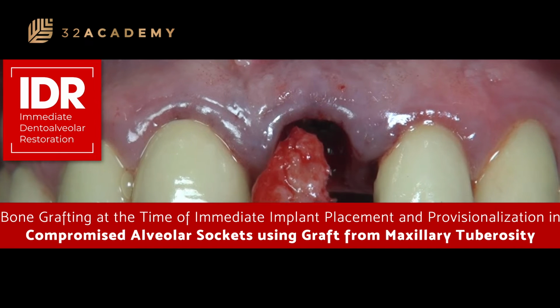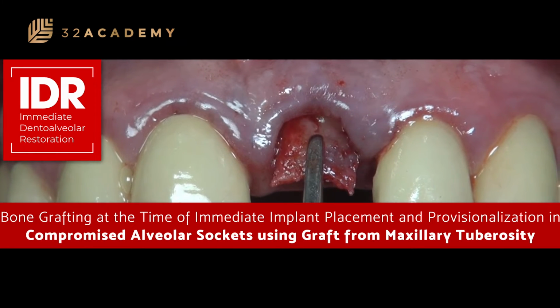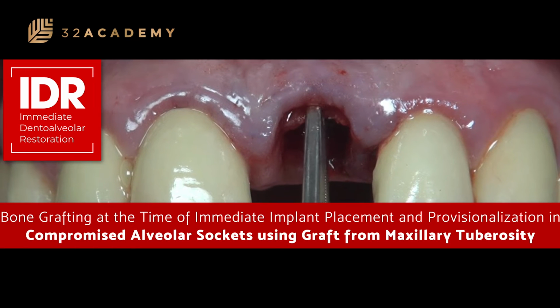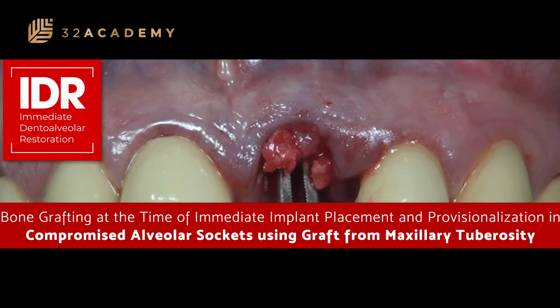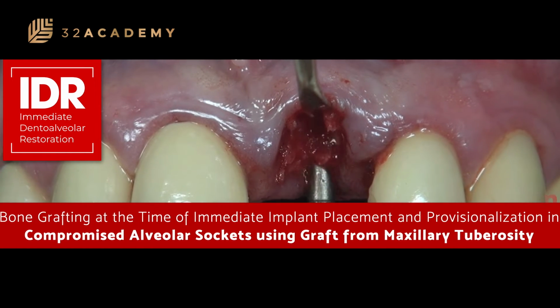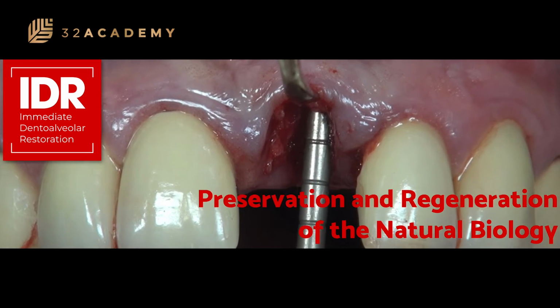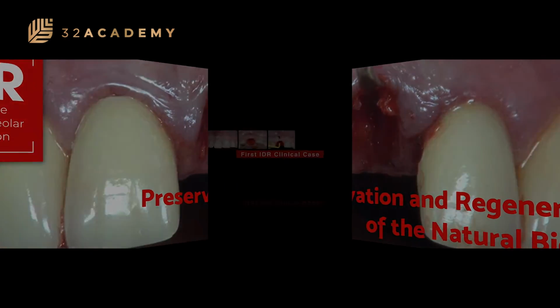IDR is a bone grafting at the time of immediate implant placement and provisionalization in compromised alveolar sockets, always using graft from the maxillary tuberosity. This technique is based on biological response. Our goal is the preservation and regeneration of the natural biology.